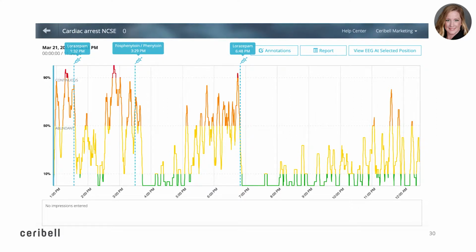As you can see, the notations for Ativan and Cerebyx on the top of the graph are entered by the nursing team. Please note the direct relationship between the medication administration and the decrease in the seizure burden graph. Monitoring interventions is squarely a nursing responsibility. We do not throw around medications without reassessing their impact on the patient's clinical picture. It is very exciting to be able to monitor their seizure burden in real time with this medication management tool.